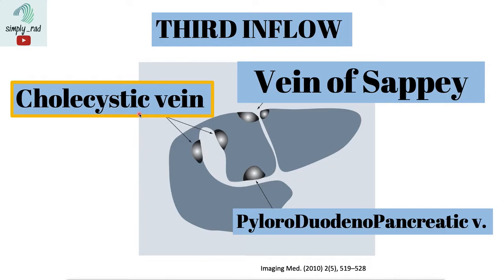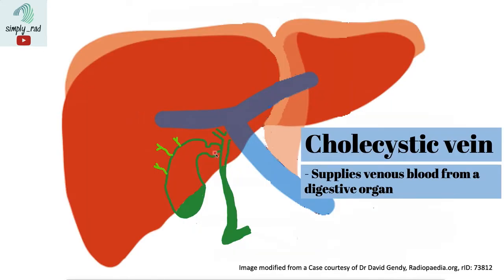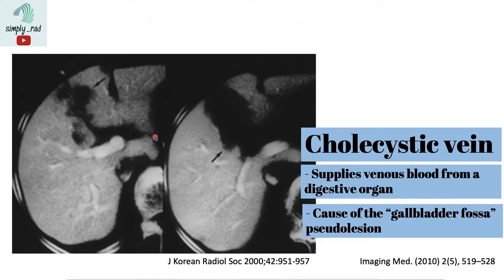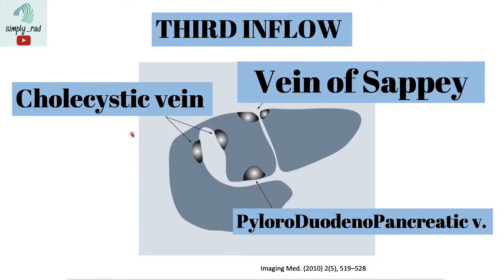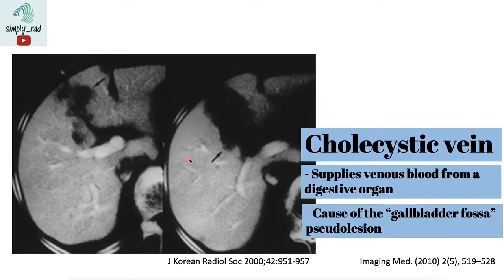Aside from the vein of Sappey, another third inflow vessel is the cholecystic vein. The cholecystic vein drains blood from the gallbladder directly into the liver, and this is the cause of the gallbladder fossa pseudolesion. One can also imagine that if the gallbladder is inflamed, there will be increased blood flow in that area, increasing flow through the cholecystic vein and creating a possible increase in enhancement in the gallbladder fossa.